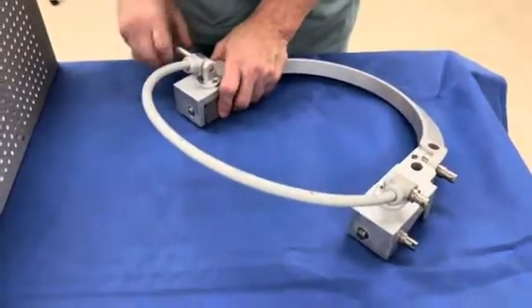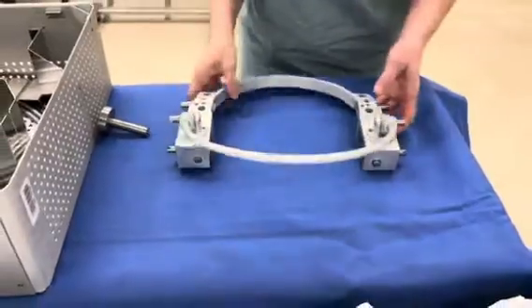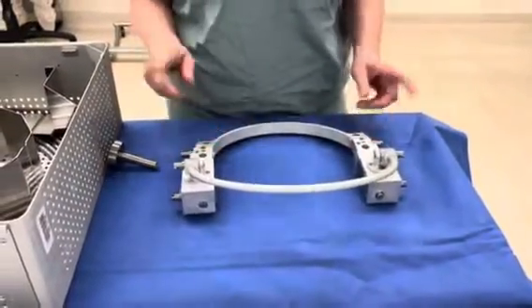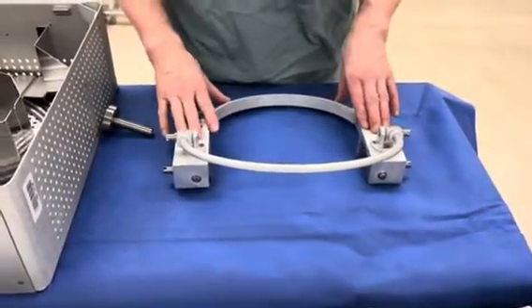Everything's nice and tight, and that's it. That's all you should have to do to get the surgeon ready. Ask them if they're going to use this piece — if not, you're just getting the bottom piece ready.